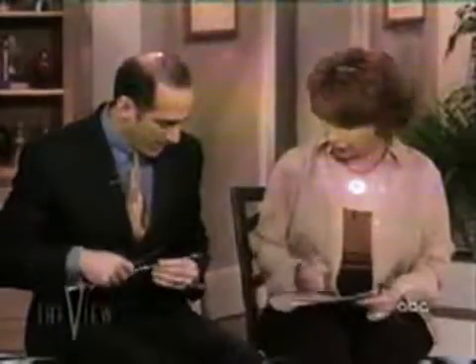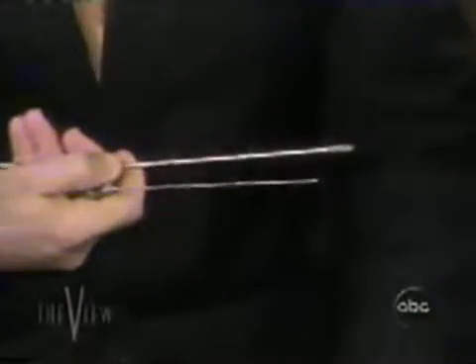Well, microliposuction takes advantage of new technology where we have smaller cannulas. We've gone from cannulas that were about this size to smaller cannulas, so there's less bruising, there are finer holes in it, and the results are better. You can go after smaller areas. So you stick this one in the chin like that? This one, that's a chin one.